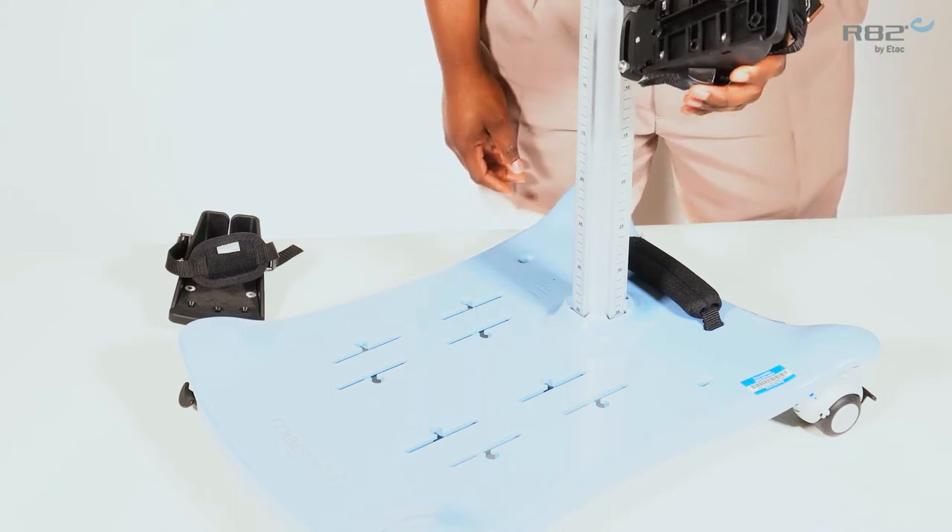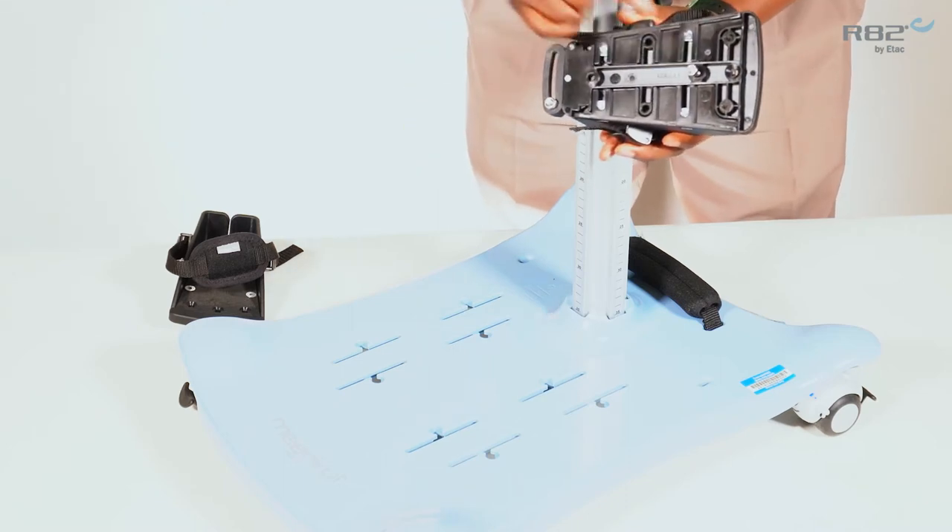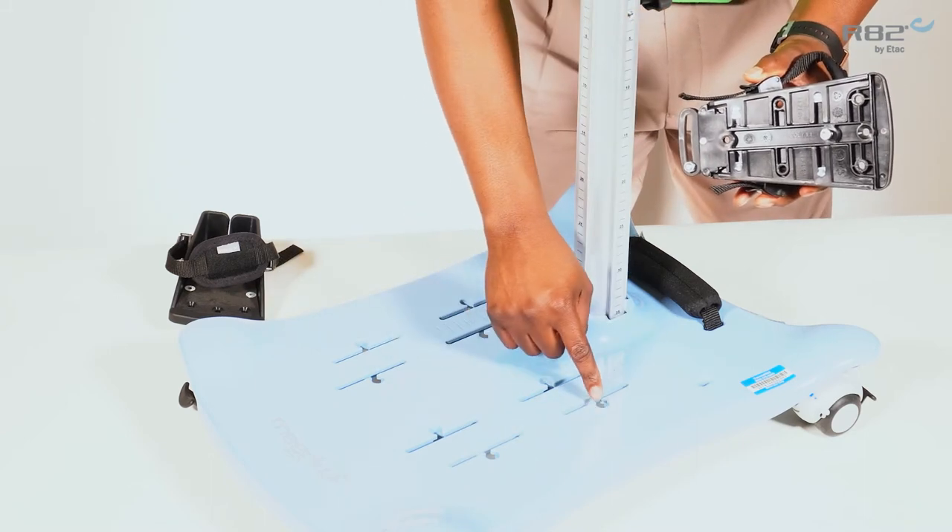To insert the sandal into the track, align the bolts on the bottom of the sandal with the insertion points of the track.